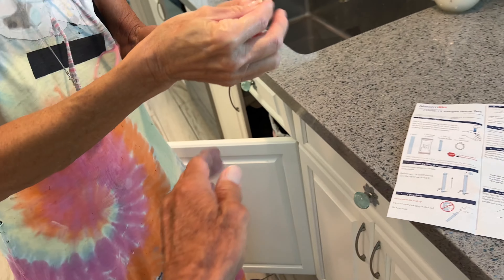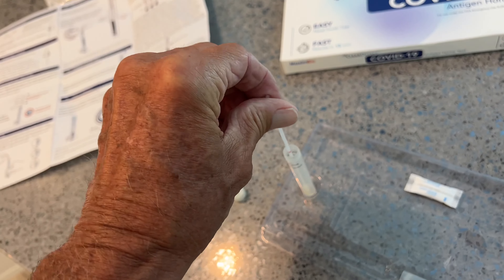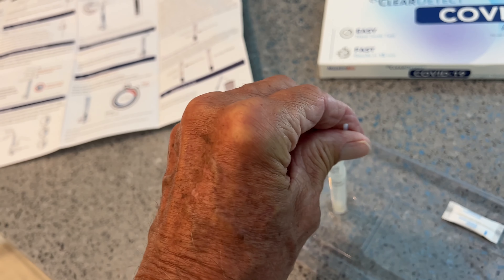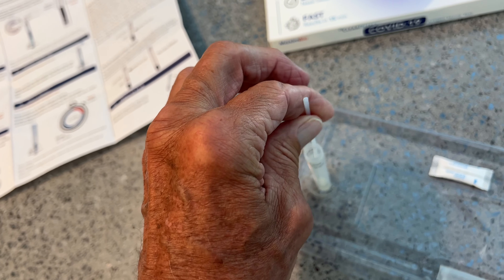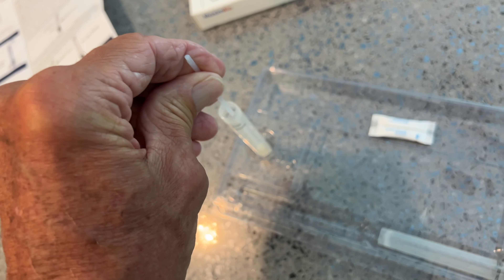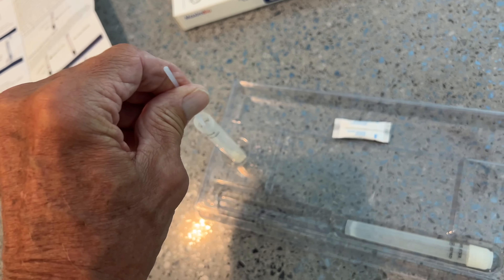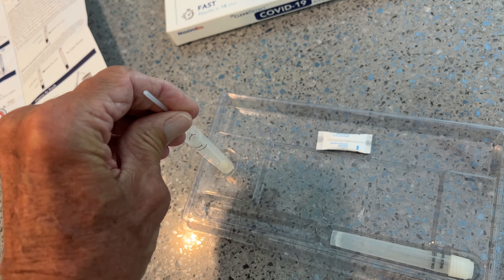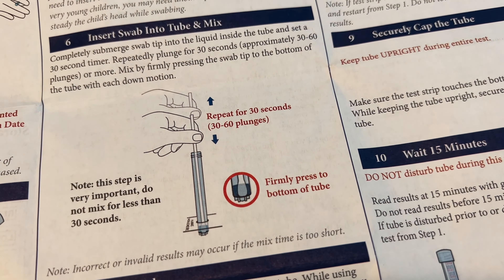All right, hang on — don't break it off yet. I got to stick it in and plunge it. So this has got to do — what did they say — like 30 good plunges in here. 30 to 60 plunges. So 1, 2, 3, 4, 5, 6, 7, 8... all the way to 30. Did you just say 30 to 60? Yeah. Well, is it 30 or is it 60? It says 30 to 60 plunges. So what do you do, 40? Repeat for 30 seconds.